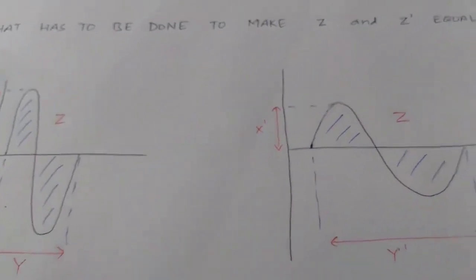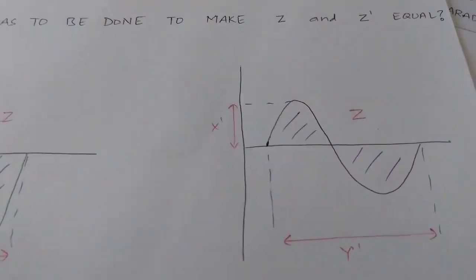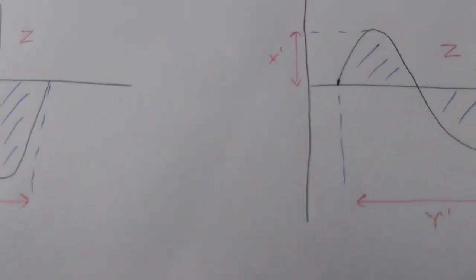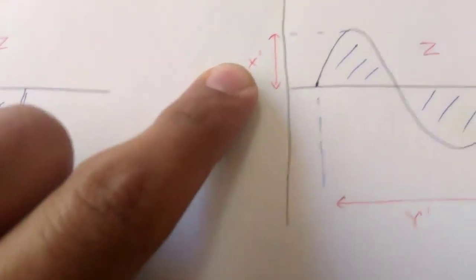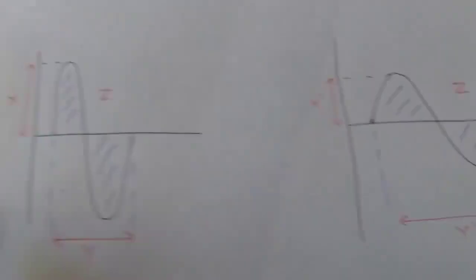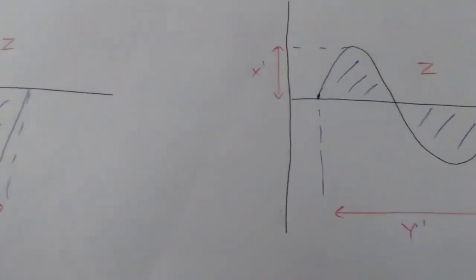So if we can achieve that with the lesser intensity, that would be the favorable one, because it is the intensity that produces the discomfort. The lower intensity will produce lesser discomfort for patients, and higher intensity will produce more discomfort to the patient.